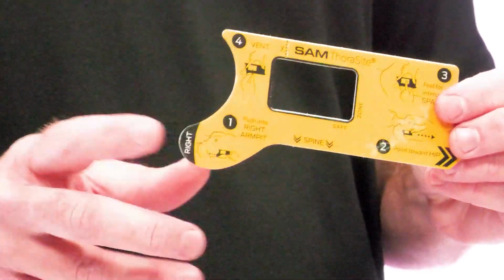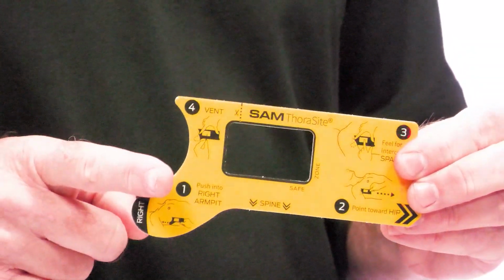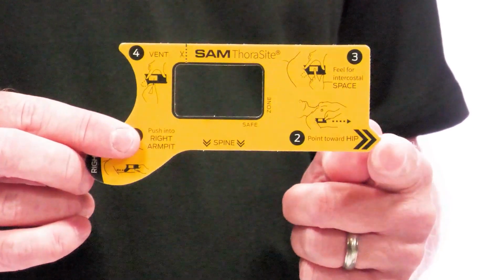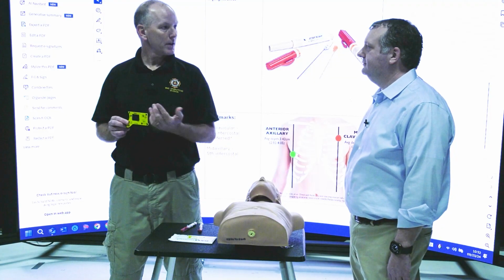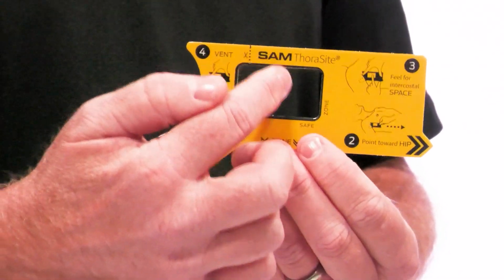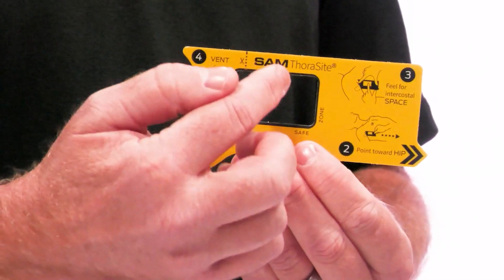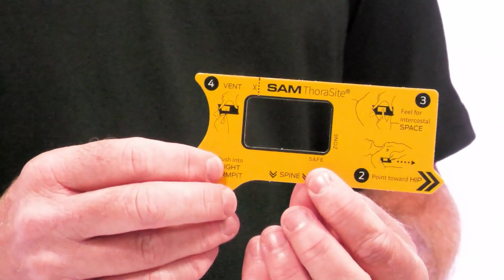As soon as we put this up underneath the armpit, arm at 90 degrees, the little hook will go up under that armpit. As long as you have this arrow going towards the hip, there's your window. Now, the biggest thing I saw when I read all the literature was, what happens if you can't identify that? We're cool with going straight in the middle. Correct. So very, very simplistic.